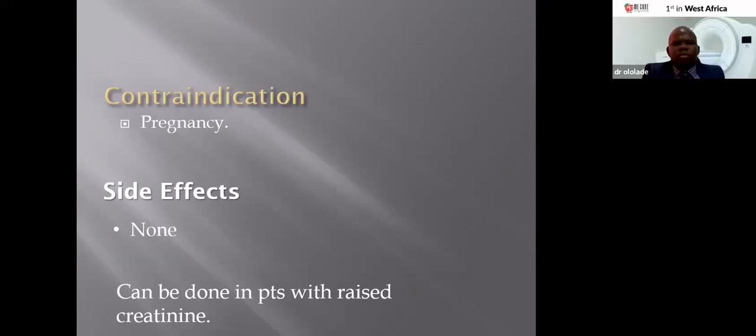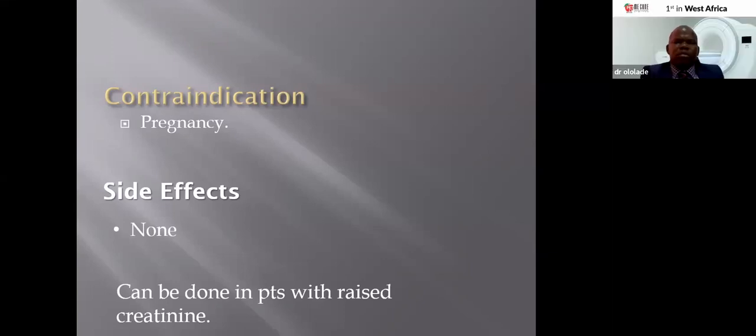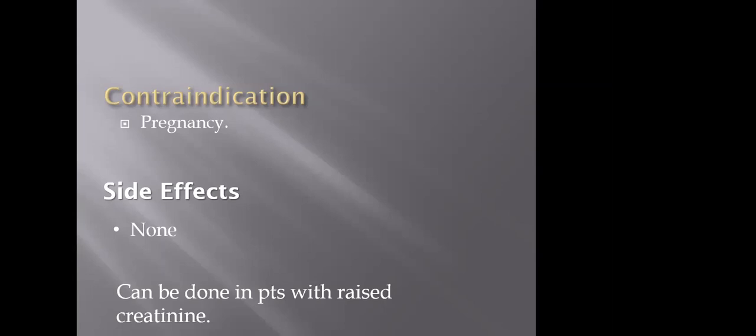Next slide. There are no contraindications except pregnancy. There are no side effects, at least I have not encountered any in my 15 years of practice, and there are no obvious documented side effects of the radioisotope FDG in literature. And the beauty of the PET scan is that it can be done irrespective of the serum creatinine levels.